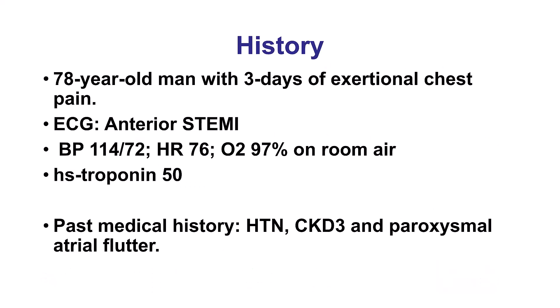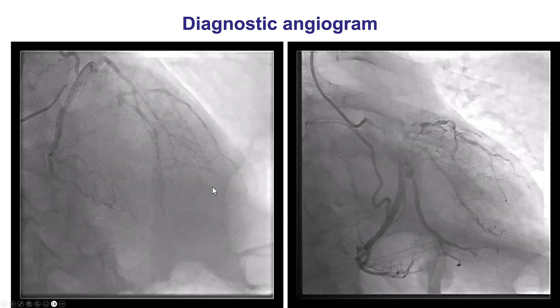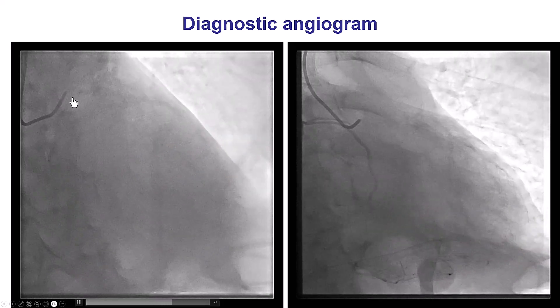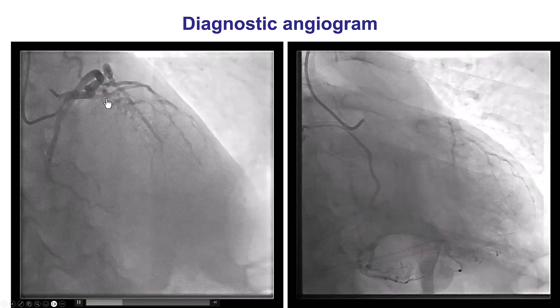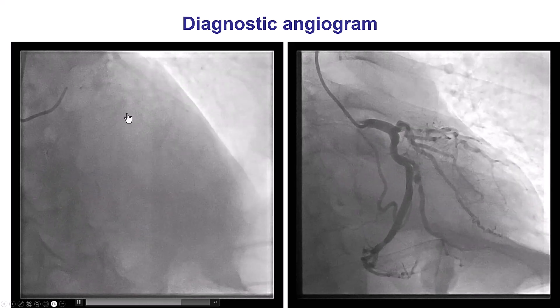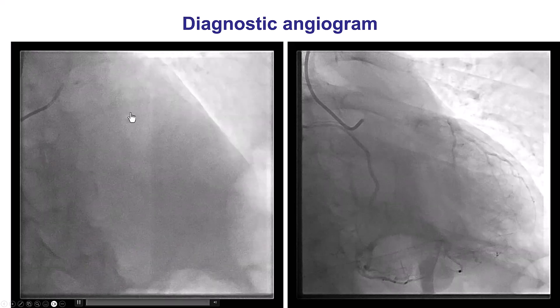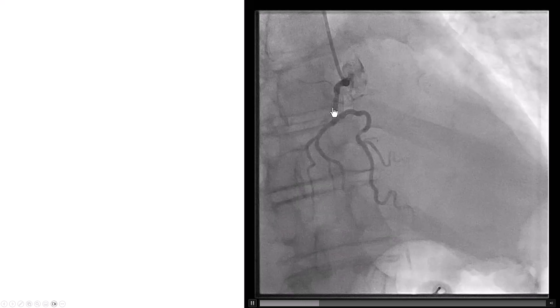The patient presented with anterior STEMI, classic findings and increased troponin, and was sent for emergent coronary angiography and PCI. This is a diagnostic angiogram, which is a little challenging to interpret as there is quite some tortuosity earlier on. There is occlusion of the LAD, with some faint filling of the LAD distally through ipsilateral collaterals. The coronary artery is also providing some epicardial collaterals supplying the distal LAD.